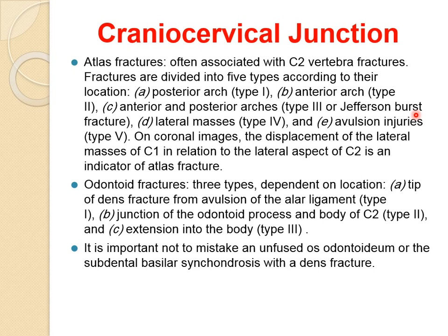Okay, good. Odontoid fracture is another fracture. Mostly there are three types. First, a tip of the odontoid process. Second, the junction of the tip with the body. A third one extends into the body. It's important not to mistake an unfused odontoid or the subdental basilar synchondrosis for a dens fracture, which we see a lot, by the way.